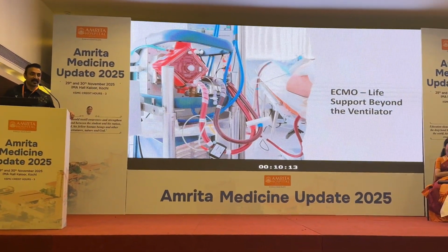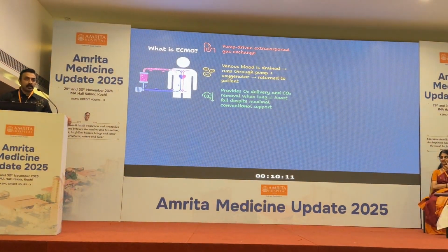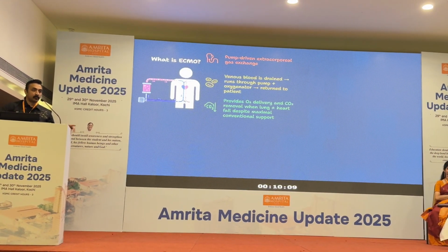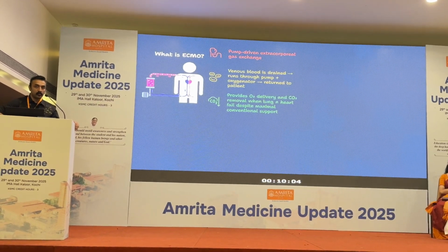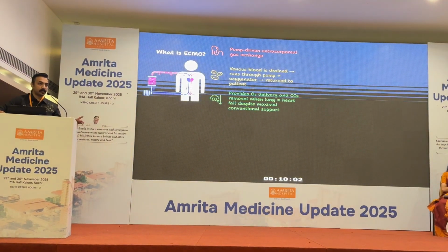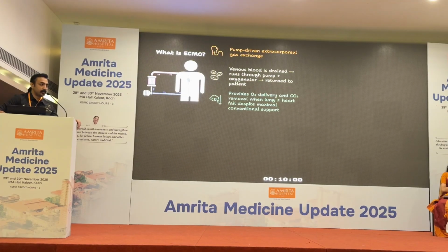the big guy in the room, that is ECMO. So we currently have a patient on ECMO in the 5-4 ICU. So the residents who are in such units are quite familiar with the basic circuits and everything now.